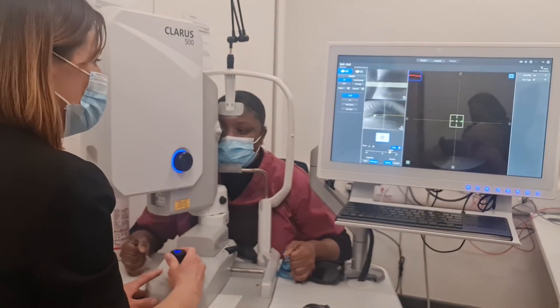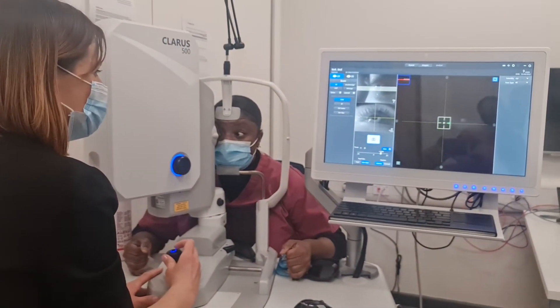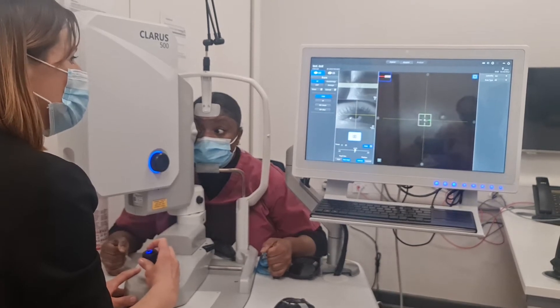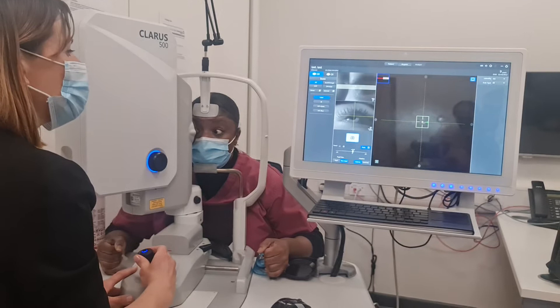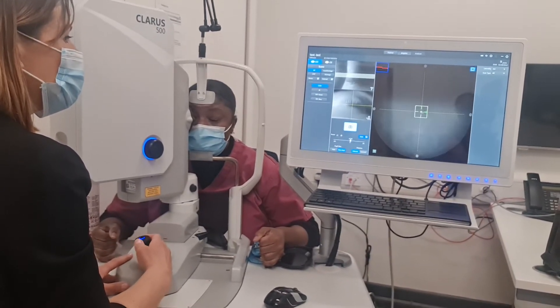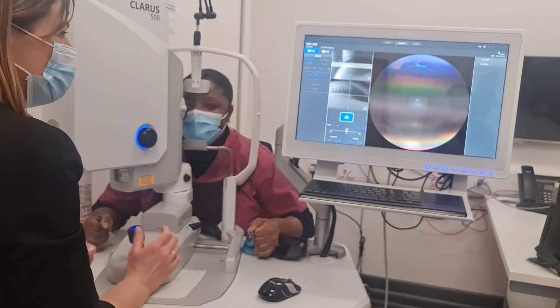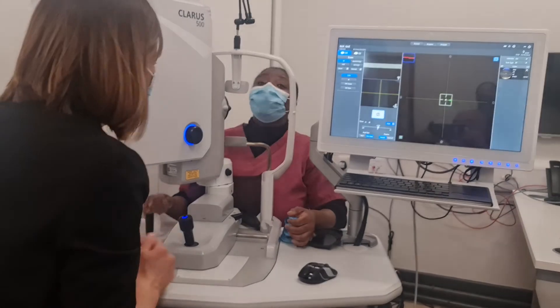Thank you, very nice and wide. Thank you very much. Not today, thank you very much. Oh, this is my lazy eye. Ah, that's your lazy eye. It's the small lid, isn't it? I'm sorry. It's the small lid, yes.